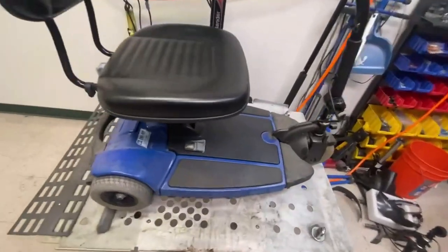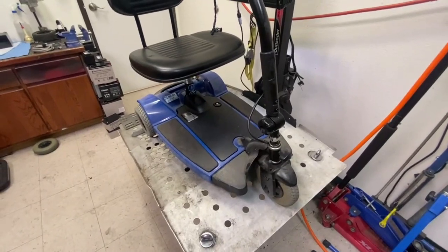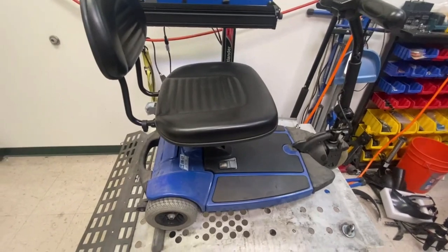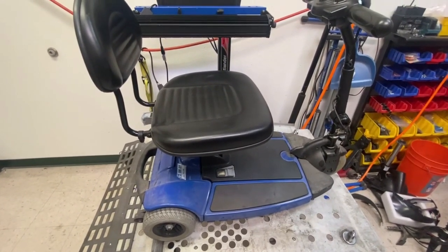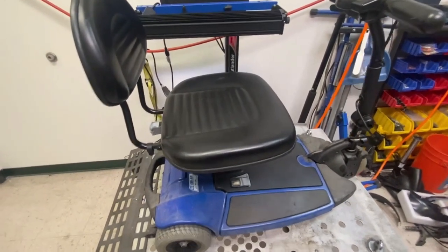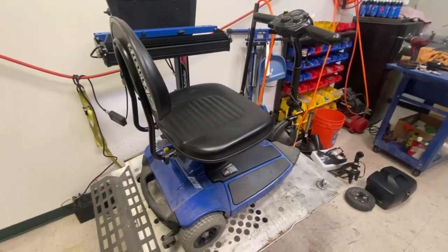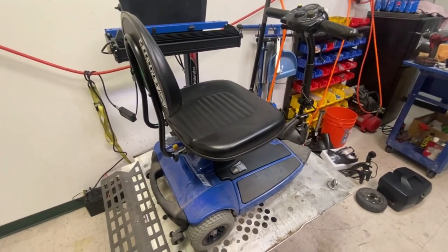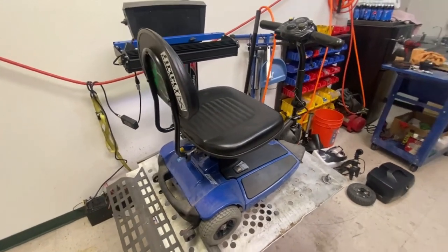It looks very similar to the Sonic, which was the second release after this one. The lady came in, bought new batteries, and then came back again saying that the scooter won't move, even though the battery gauge shows good. So I'm going to put some batteries in it and go through to see if I can diagnose what the problem is.